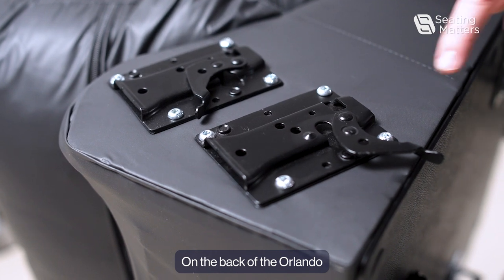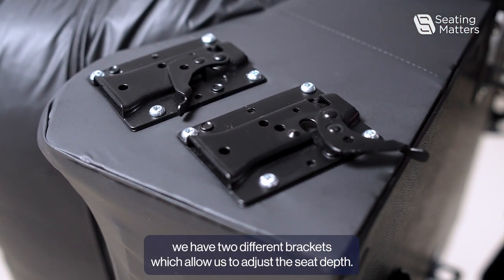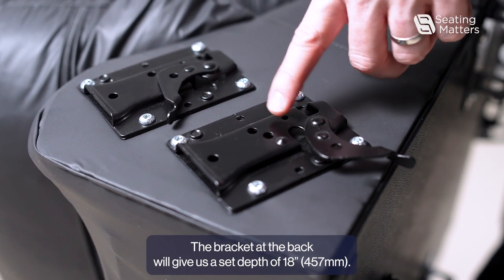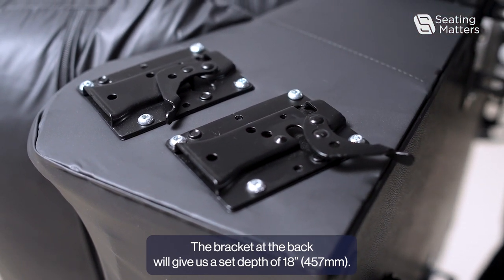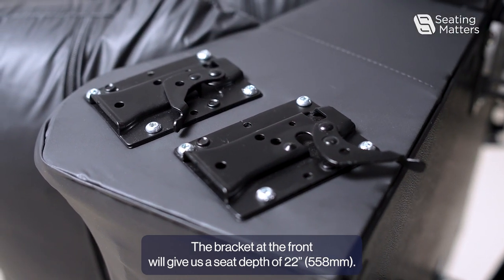On the back of the Orlando, we have two different brackets which allow us to adjust the seat depth. The bracket at the back will give us a seat depth of 18 inches. The bracket at the front will give us a seat depth of 22 inches.